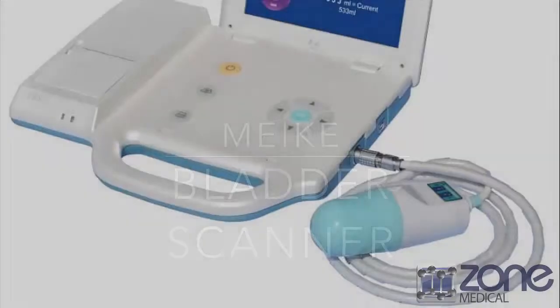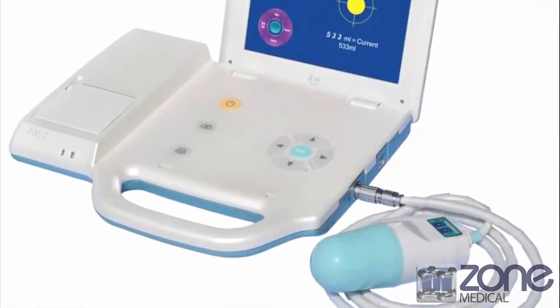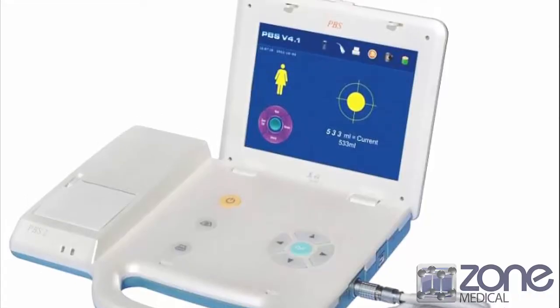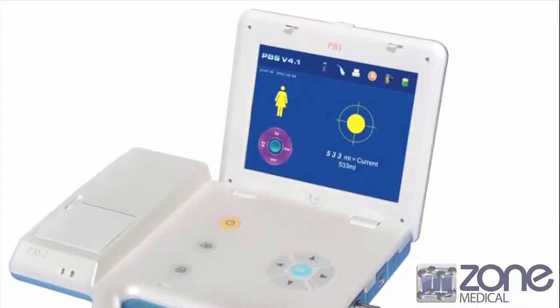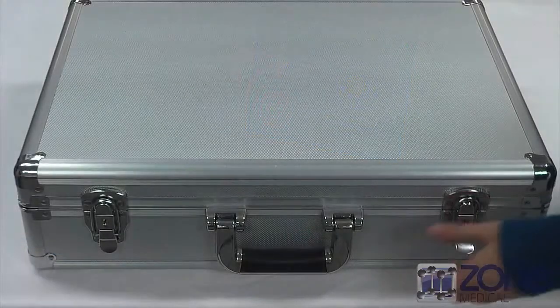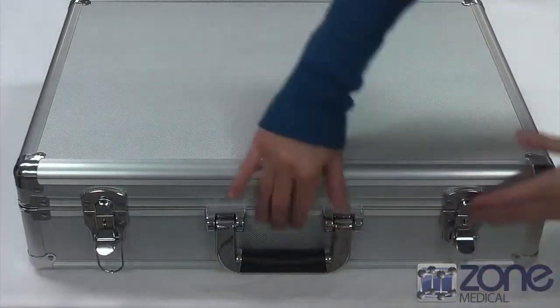Today I will be speaking to you about the PBS Bladder Scanner. The Palm Bladder Scanner is a handheld non-invasive device with advanced 3D ultrasound technology. It provides a quick and accurate measurement of the bladder volume, done with ease and comfort for the patient.